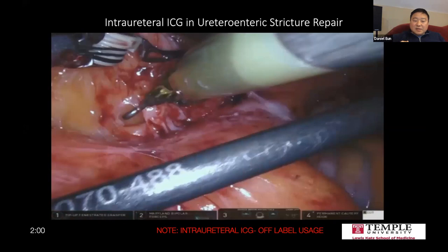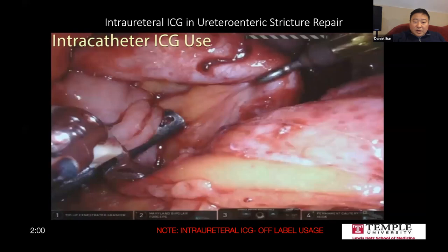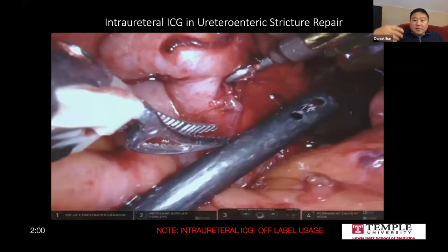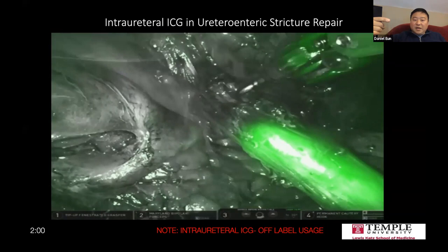And so here in the left ureter, down the PCN, we put in 5 cc's of ICG. And as we get down to it, we are going to confirm it by turning on our near infrared. And there it fluoresces very brightly so that we can see for sure this is our left ureter before we burn any bridges. And you can see this thing just tapers off and doesn't connect to the conduit.